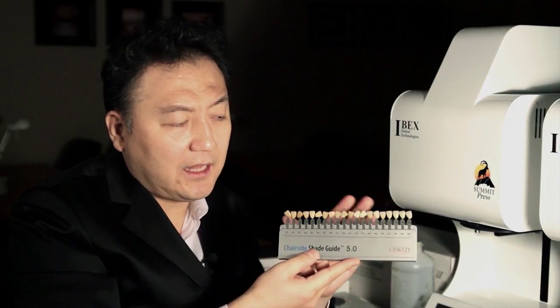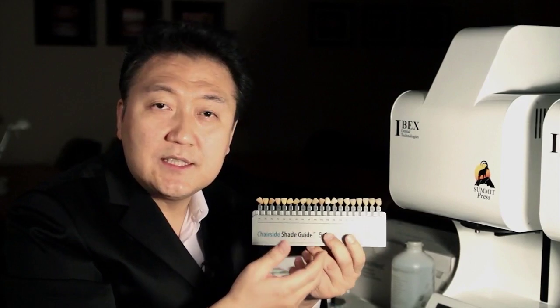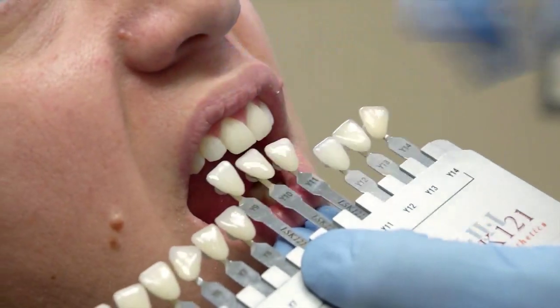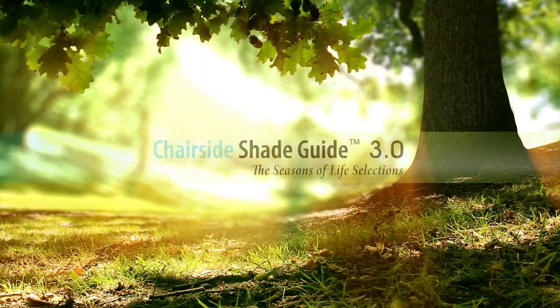Then technician and dentist can use the patient's teeth trying to match the custom shade color, and then the technician, including me, once they choose it, I use the GC Initial porcelain trying to exactly duplicate this color. We have a formula which is very simple to use. So please contact GC America, searching for the Initial porcelain system.